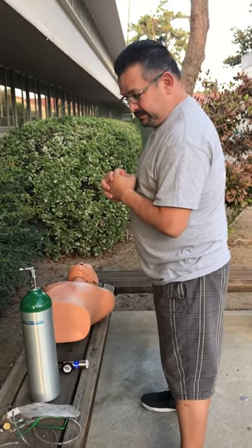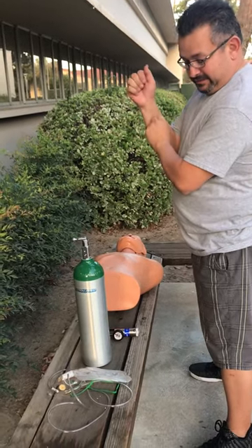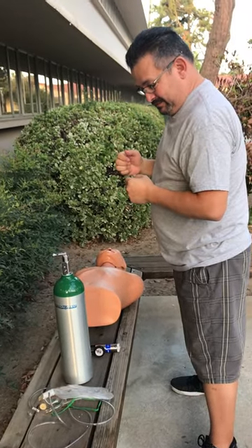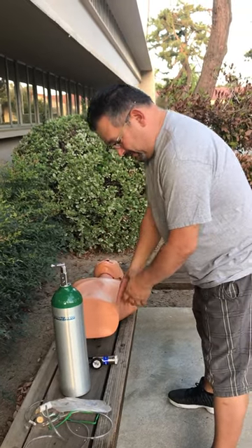Takes or verbalizes appropriate body substance isolation procedures. I am placing on my gloves. Gathers appropriate equipment: non-rebreather bag, oxygen tank, regulator, patient.